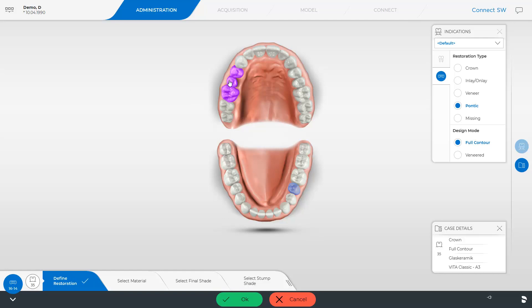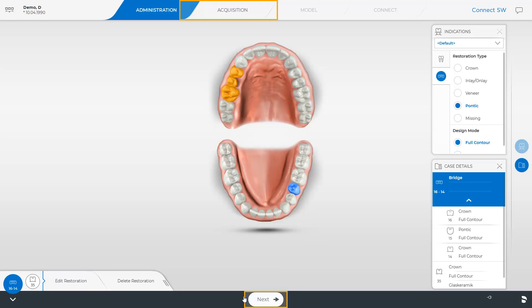In this case, we skip the optional steps, confirm with OK and tap Next to continue with the acquisition phase.